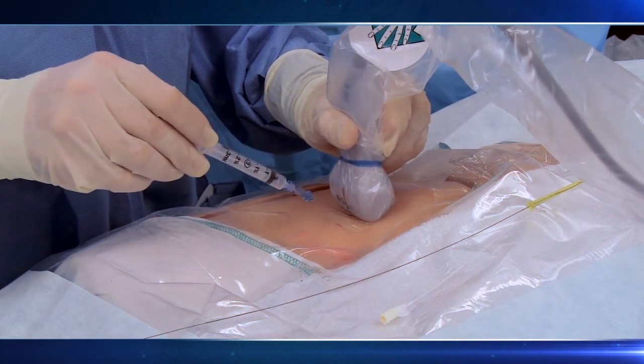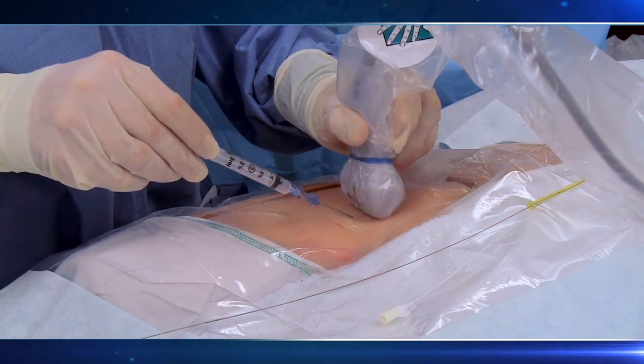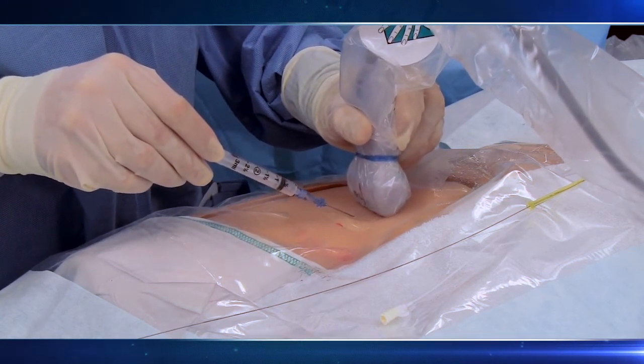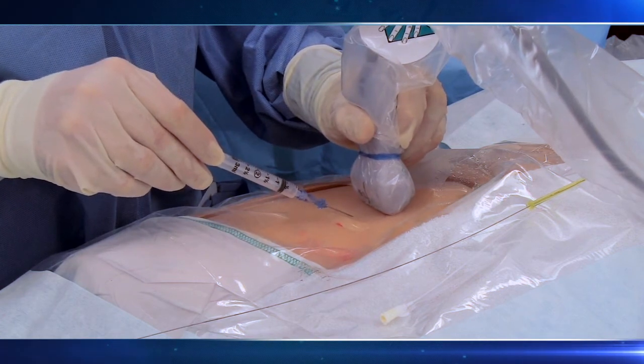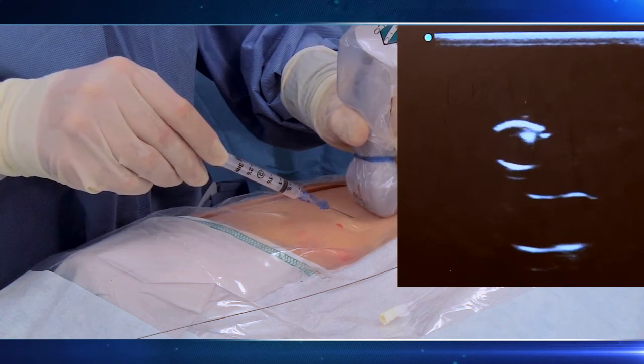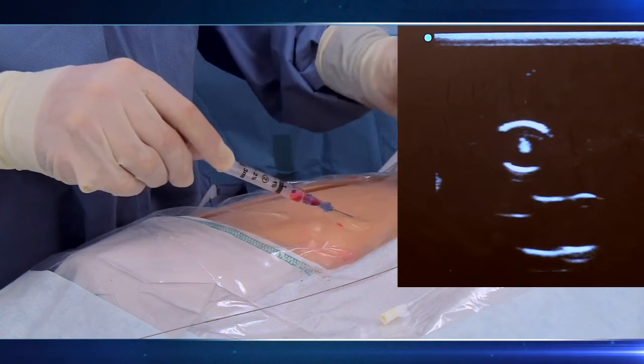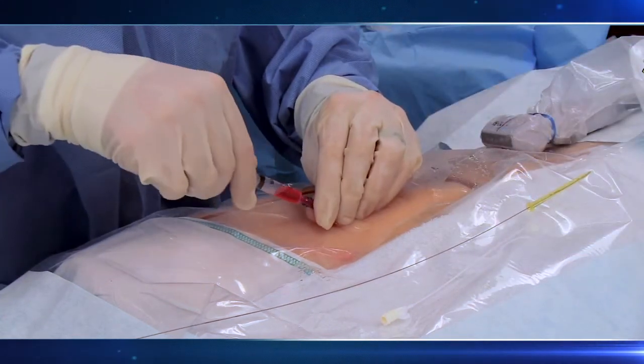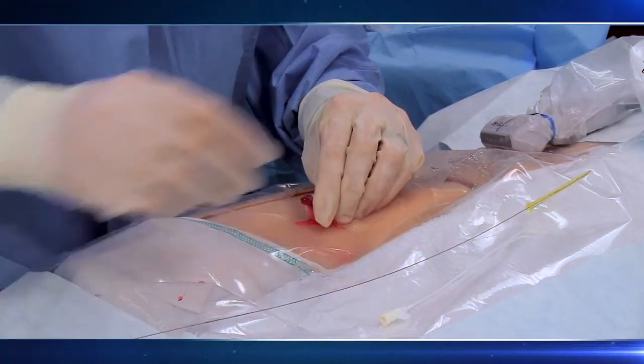Place your needle in the middle of your ultrasound probe and begin to insert it at a 45-degree angle with the bevel up. As the needle is advanced, always gently pull back on the plunger. Use the ultrasound to follow the needle tip all the way into the artery until blood is aspirated. Remove the syringe, and in a real patient, note bright red pulsatile arterial blood.